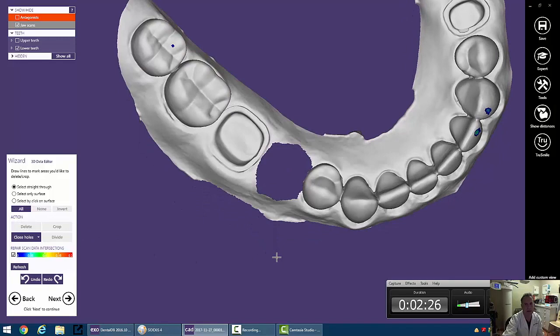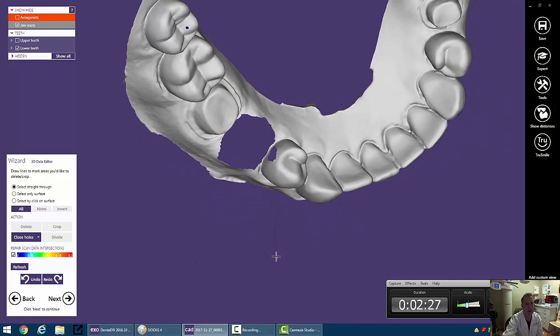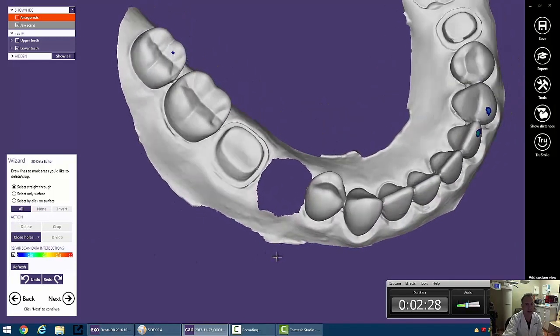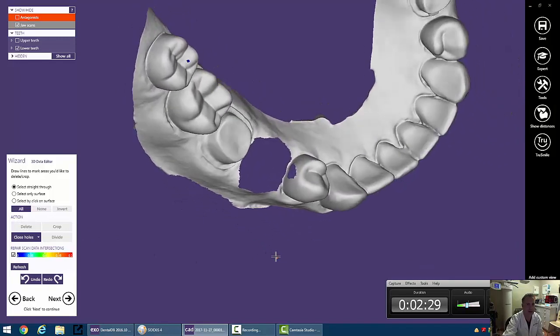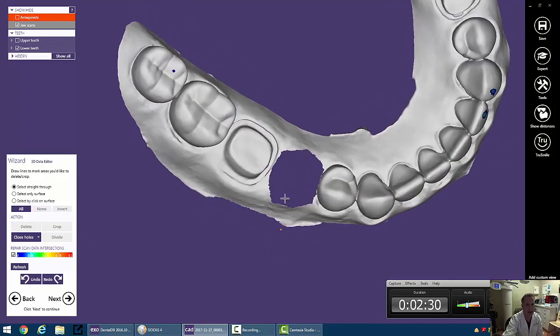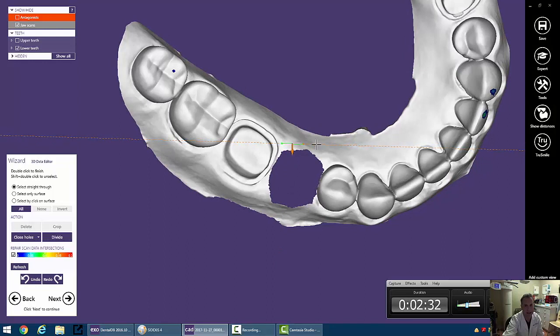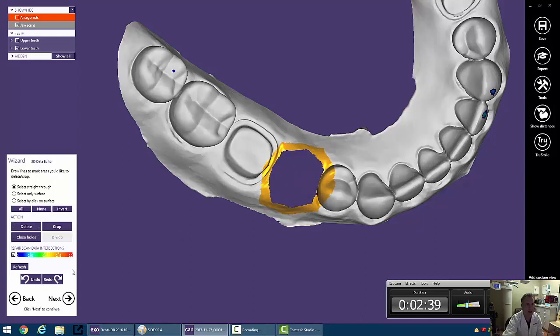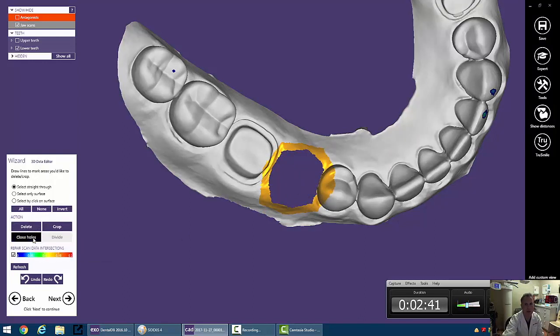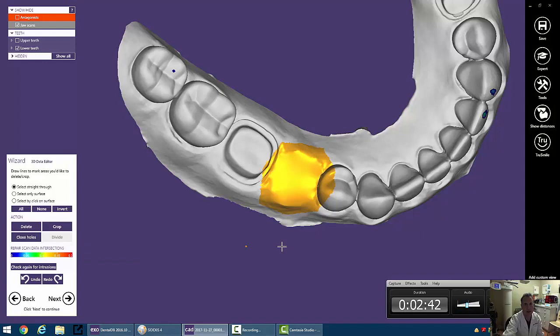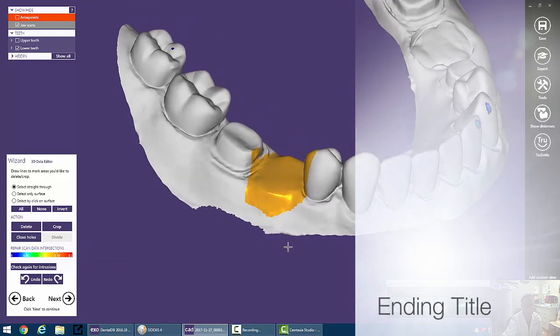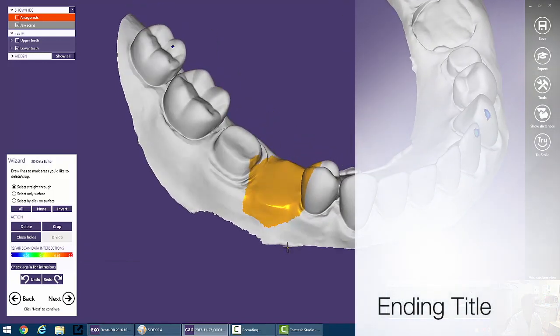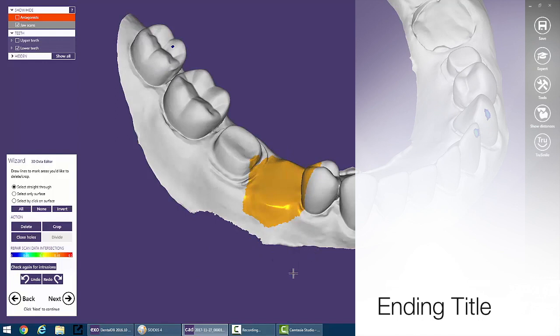Now we're left with a hole, and we want to obviously fill that hole back up. So we can go ahead now and select a fairly large area around this hole. Highlight that area, and now we can go into Close Holes. And what that will do is just fill all that in for us.